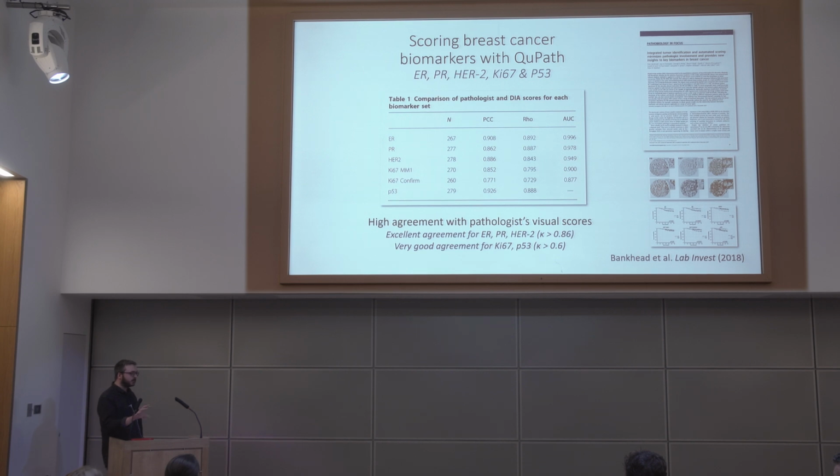but it's very hard to validate these things, particularly whenever it's so customizable. And so all of this is just really one angle on a validation of it. It doesn't fully prove the software for any one specific application. You need to think about how you validate for each application that you might want to apply it for.